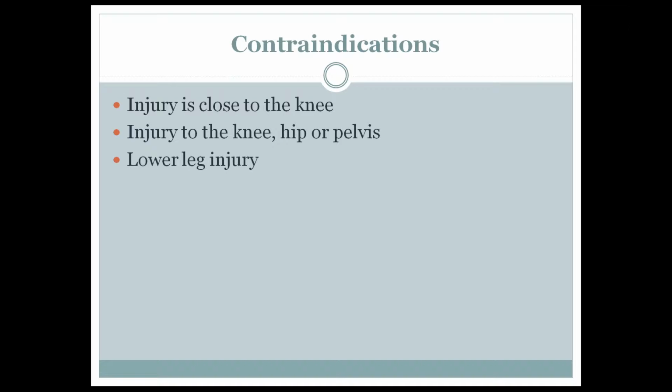Some contraindications, so what we talked about, any injury that's close to the knee, any injury that is involving the knee, hip, or pelvis, and any of those lower leg injuries like I talked about.